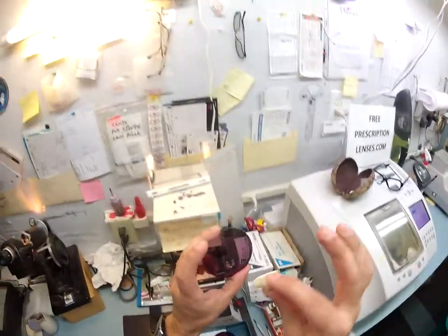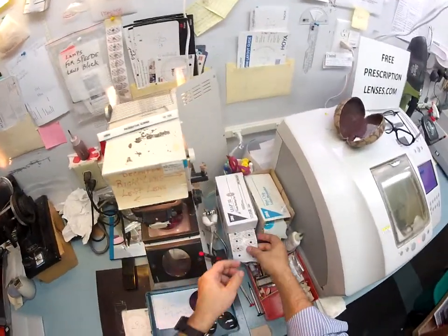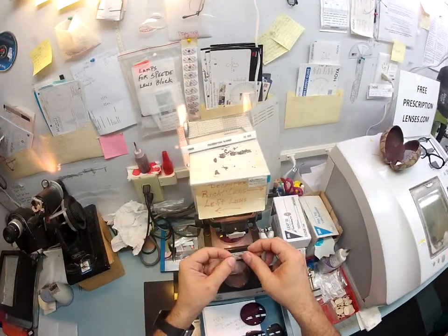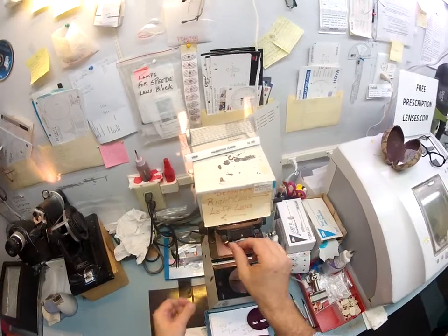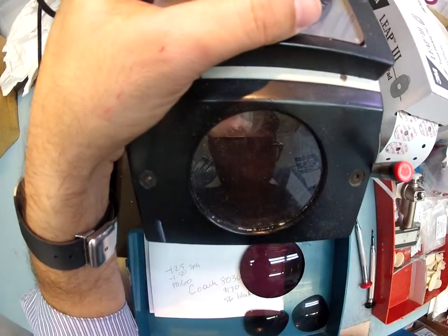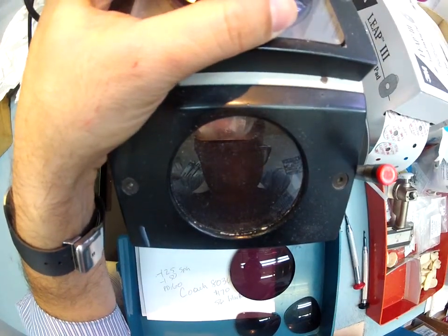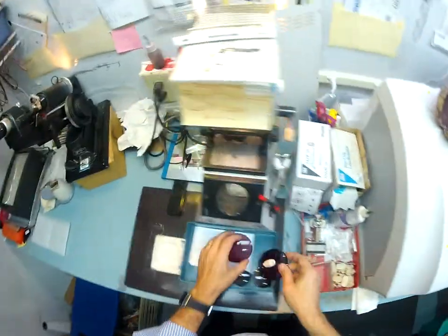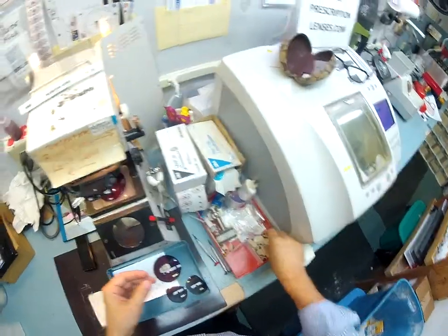But first I've got to put this block on there. This is what holds it in place while cutting. So I need to put my 3M pad, my double-sided 3M sticky pad. The black side is the sticky side. I'm going to stick that onto the block, pull the paper away to show that, and now I'm going to move everything over 5.5 millimeters and put that on there. That is your right. Let's do the same thing for your left.